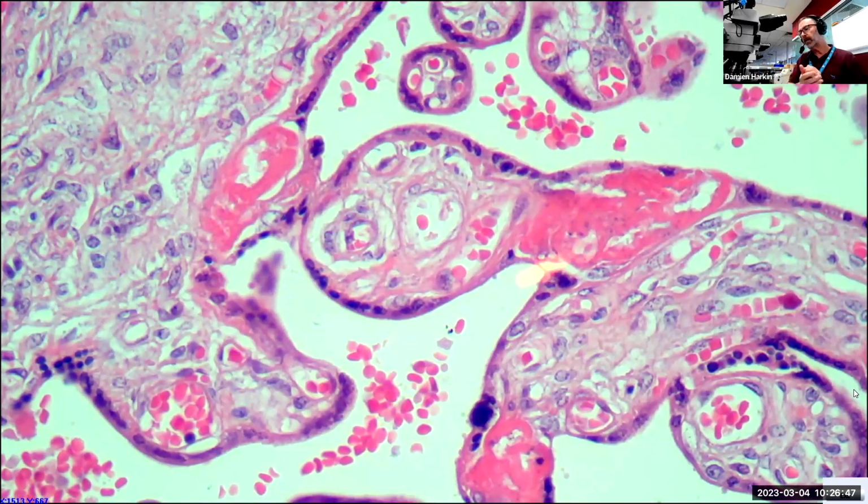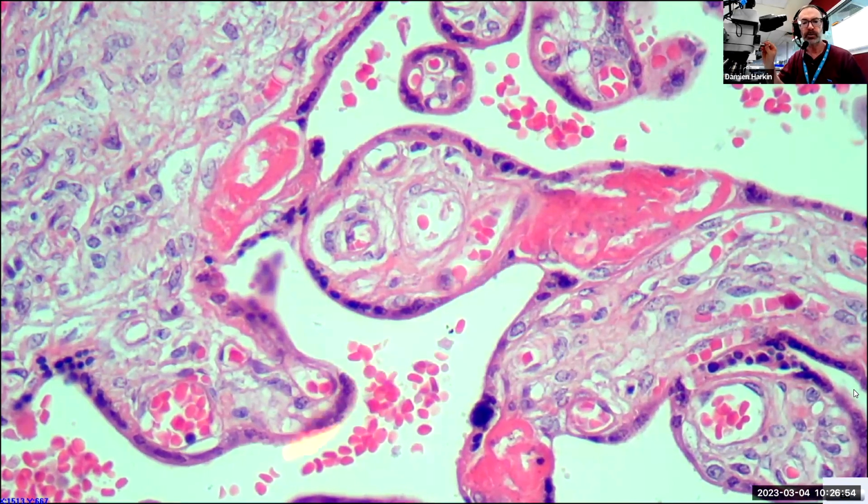So one thing that you may have picked up on the earlier slide is that wherever we found that formalin pigment, it did tend to associate with areas where there is blood or red blood cells. There's certainly many examples of that I've seen. However, it's not always the case. We had some examples in the class this week.